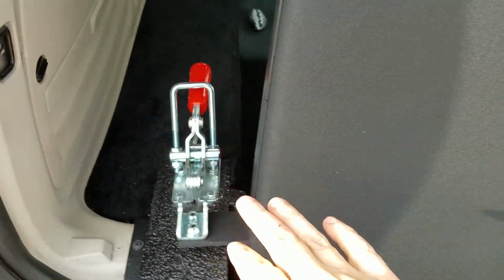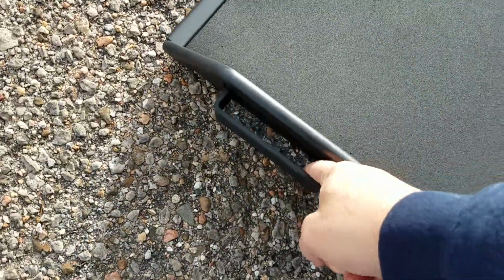These clamps in here keep these ramps from rattling. It's a very good design. They have some designs that turn or slide here in the middle. I'm telling you right now, you don't want those. They're going to rattle on you. They're going to drive you crazy. As you can see, I can take this to the ground using only my index finger.